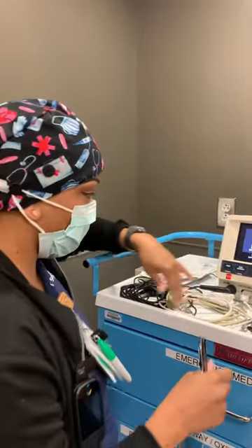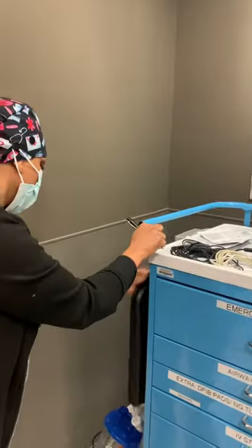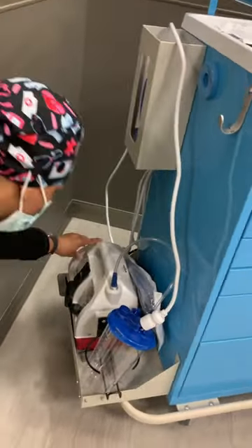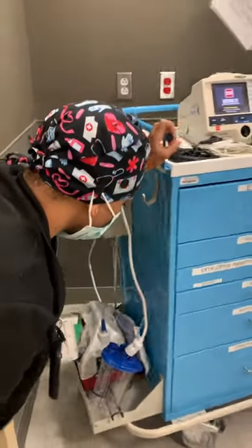Making sure that I have all of my connectors here and things to check blood sugar. Then I will move on to the side of the cart to check for my medium-sized gloves. The suction is working. Then my locks are intact here.